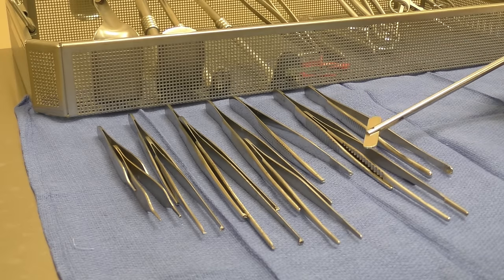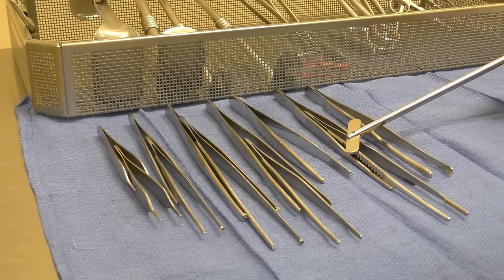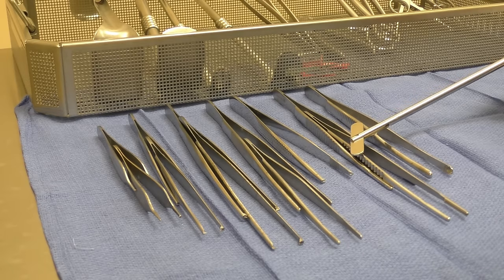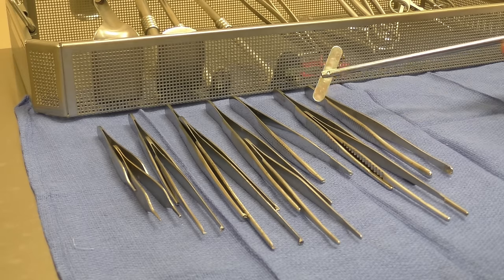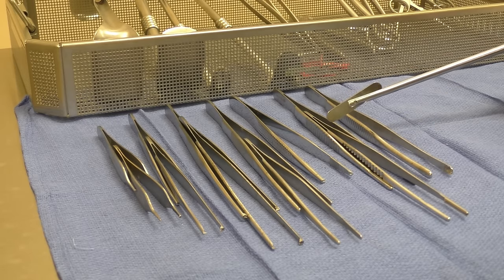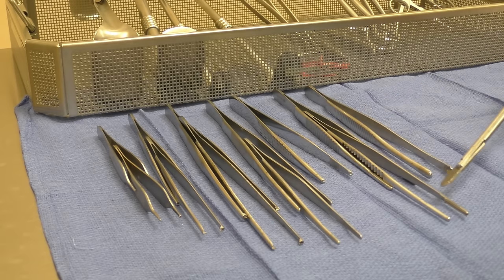The DeBakey, this forcep here is going to be used all the time. This is the DeBakey vascular forcep. And it's used, I mean, basically as soon as the incision is made and they're bovying down to, you know, where they need to fix the problem, they're gonna be using this DeBakey, you know, the entire way through. Sometimes surgeons even use this to close the subcutaneous layer of tissue.